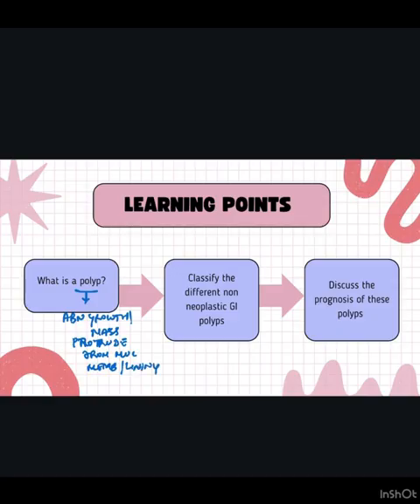Polyps are always seen in organs like the colon, the stomach, the uterus, etc. Now, it is very important to identify whether this polyp is non-neoplastic or neoplastic.